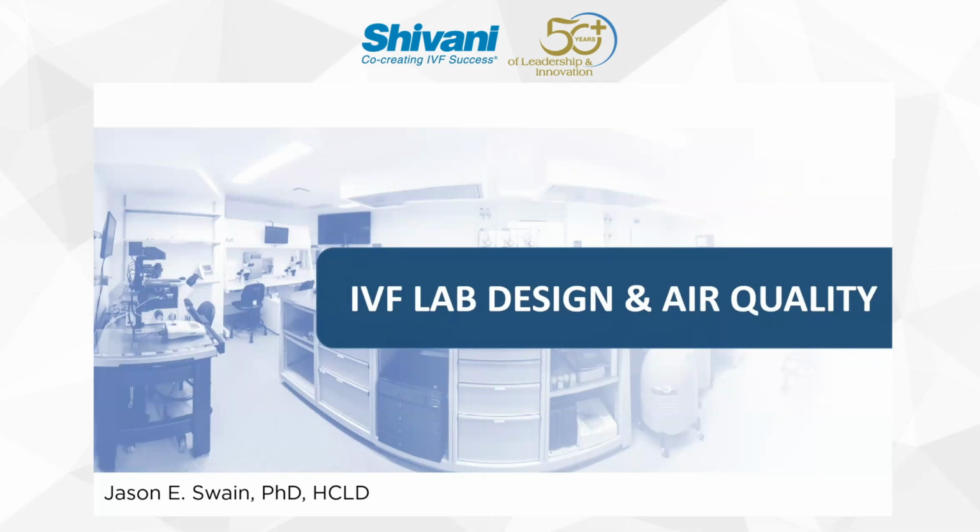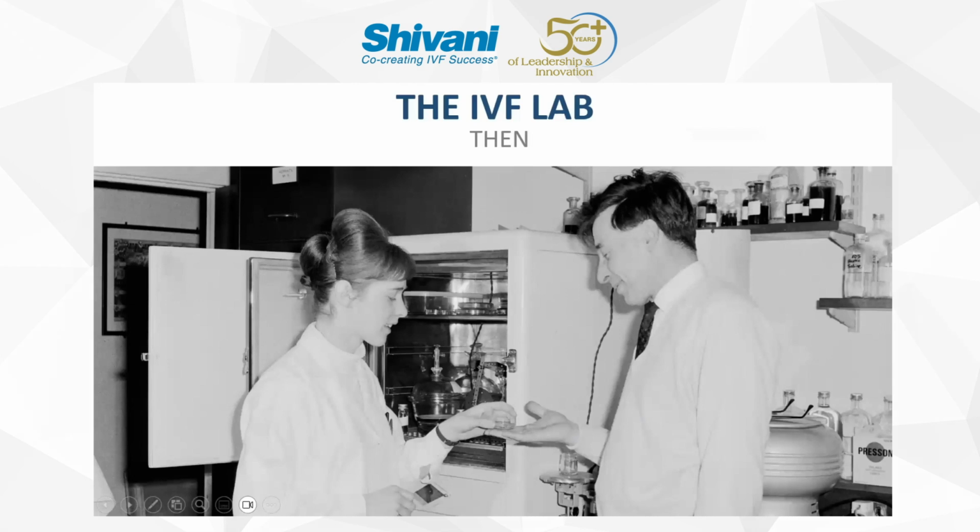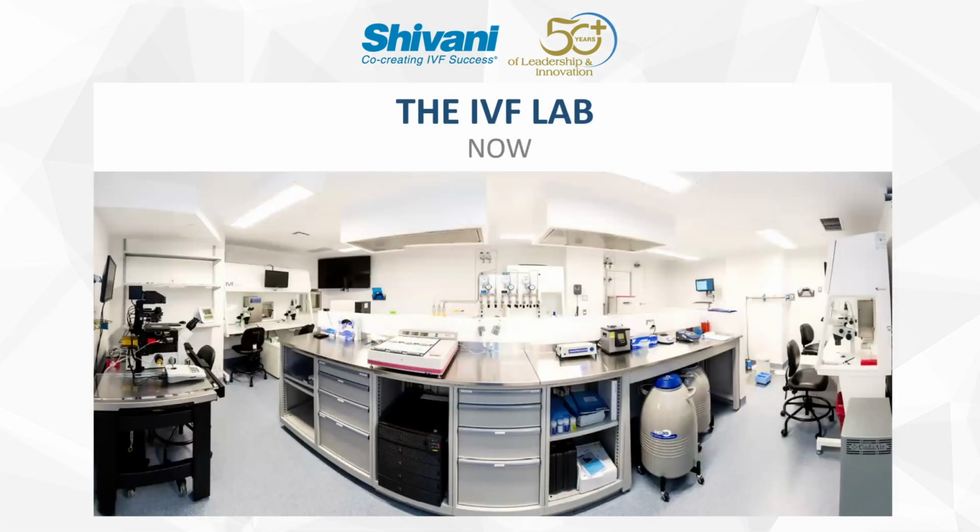So just to expand a little bit on the discussion thus far and talk about air quality, clearly the lab has evolved immensely since the early days of IVF. Here you can see an example of arguably perhaps the first clinical IVF lab with a box incubator and a bell jar inside, really a modified research lab. Fast forward to now, we saw that amazing video at the beginning of the webinar and some of the images and slides thus far showing a modern IVF lab.